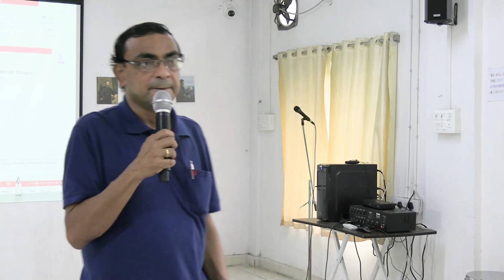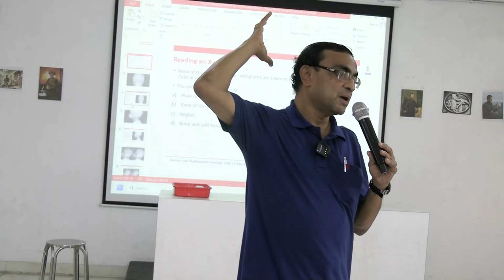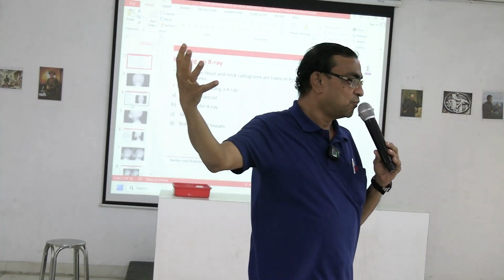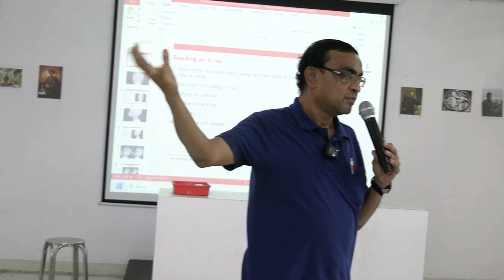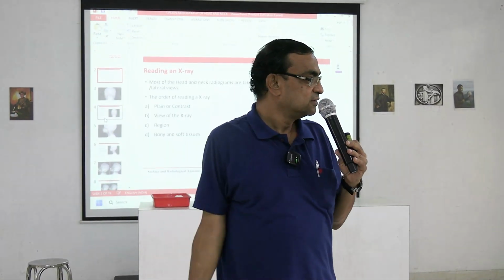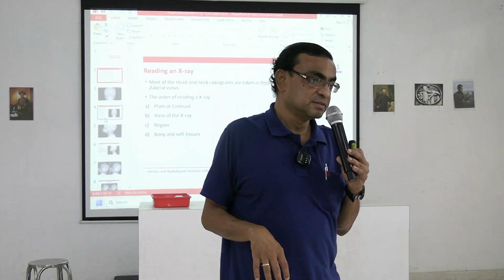Among them, the X-ray source might be from the back, from the front, or from either the right or left lateral side. Accordingly, we can get several images.